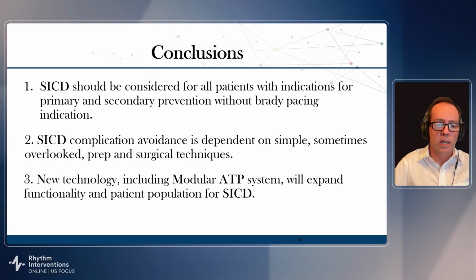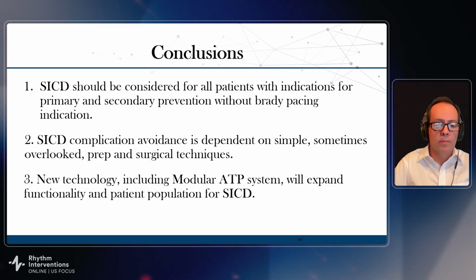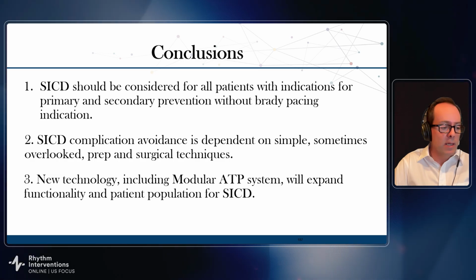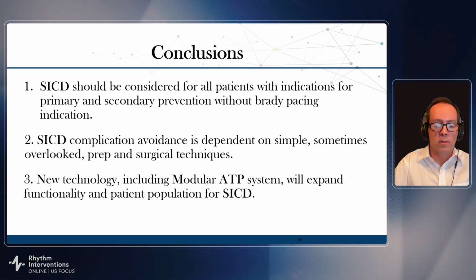The transvenous leads are destined to fail, and I would vehemently debate anybody that says less than 1 in 10 patients at 10 years doesn't have a problem with a transvenous lead.